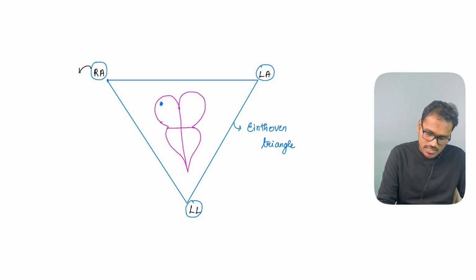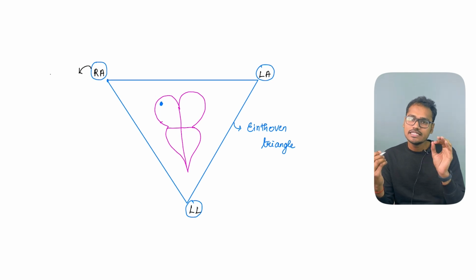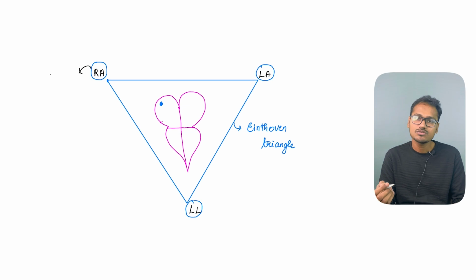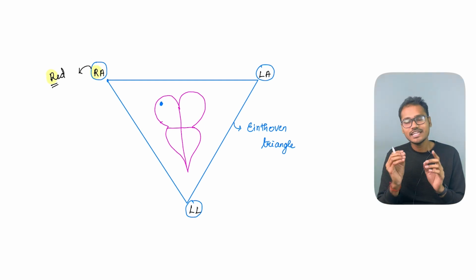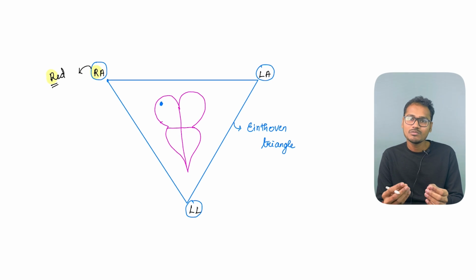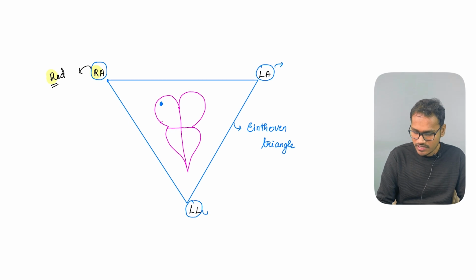If you are going to a standard ECG setup and recording and placing the leads or the electrodes, what you will observe is these are standardized, and whichever is attached to the right arm, they are generally red in color. You can easily remember R for R. Why it is important is, if the leads are interchanged, then the person might be normal, but there will be an abnormality in the ECG just by changing the leads. We will try to understand those concepts also in the coming videos. Then we have the left arm, then we have the left leg.